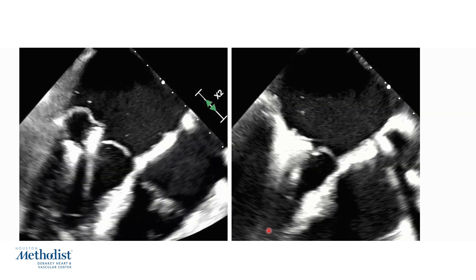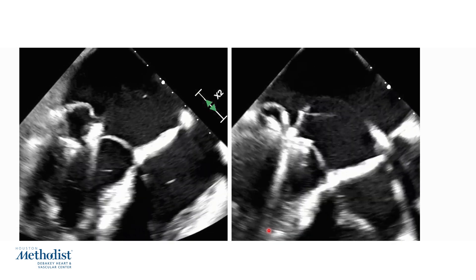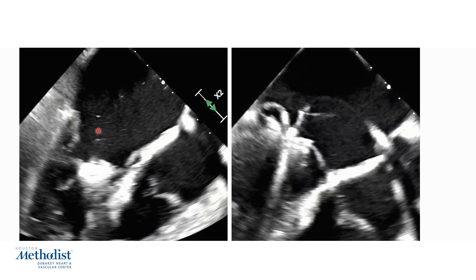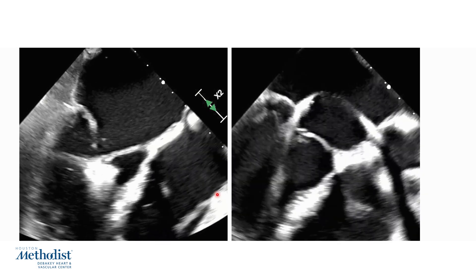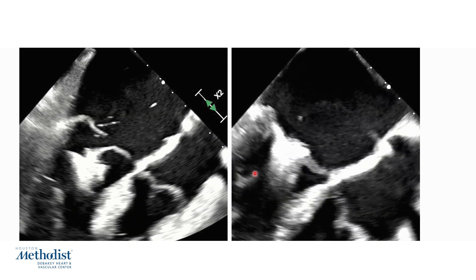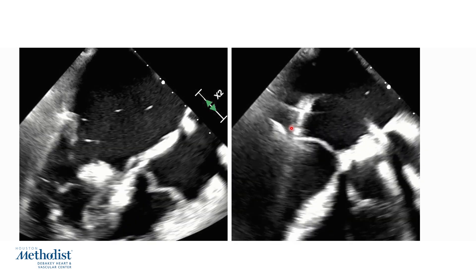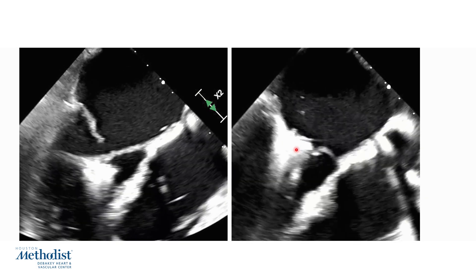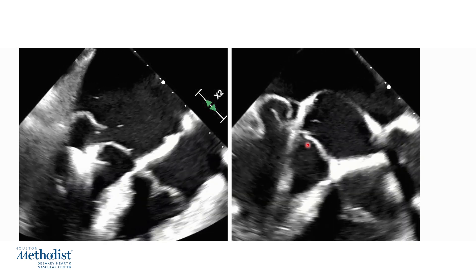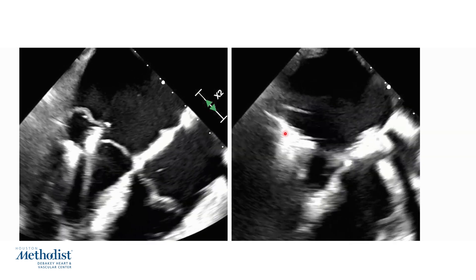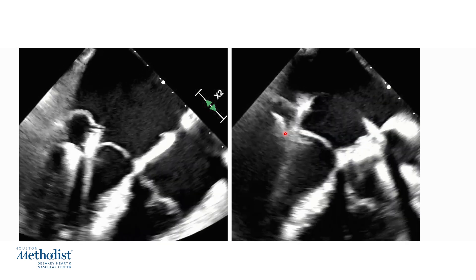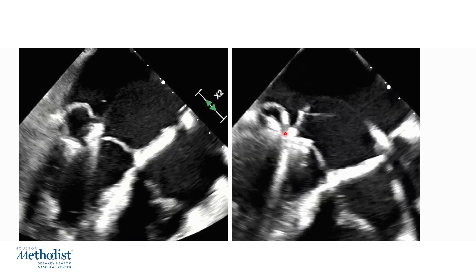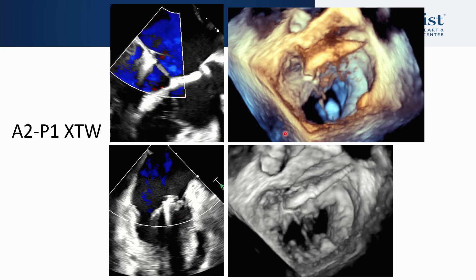Here are the 2D grasping views, typically a long axis view. You can see the two arms of the clip are open and the big P1 flail is clearly visible, along with the anterior leaflet. Under careful visualization, we retract the clip and allow the flail segment of the posterior leaflet to fall on the posterior arm and the anterior leaflet to fall on the anterior arm, then drop the grippers. You can clearly see the grippers are bouncing in both arms, indicating an excellent grasp. We use these 2D images to visualize the grasp — the most important part of the procedure.